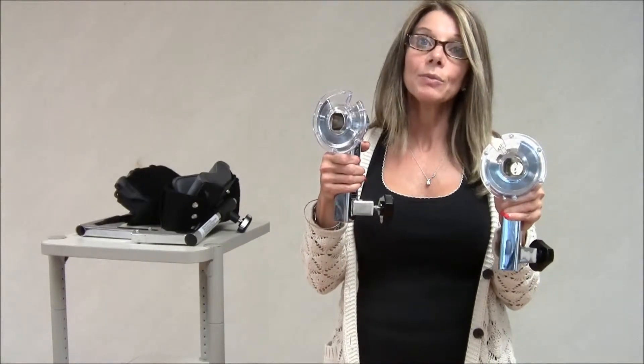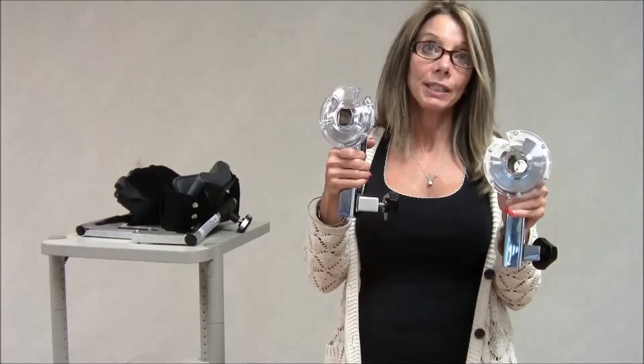Whereas the adult hip attachment, you could do it in standing, supine, and sideline.